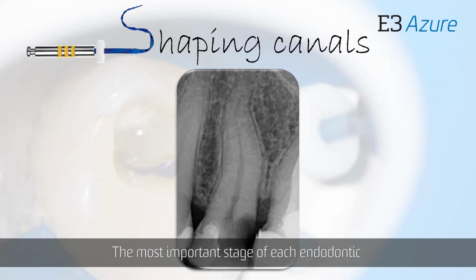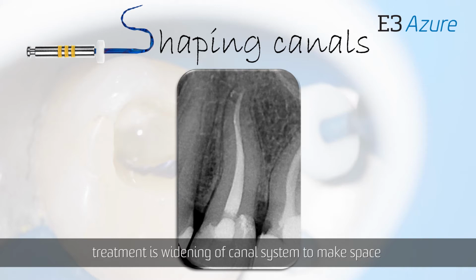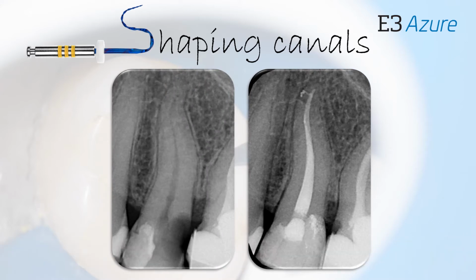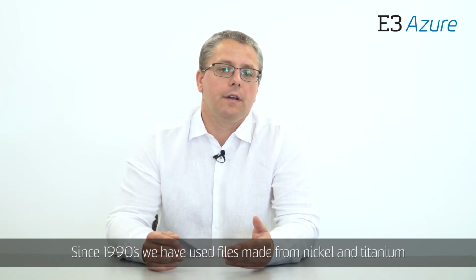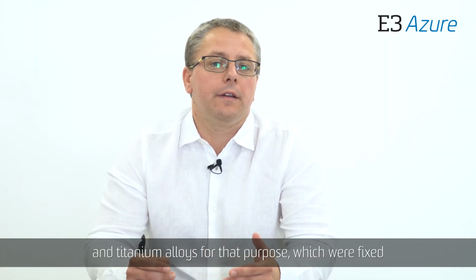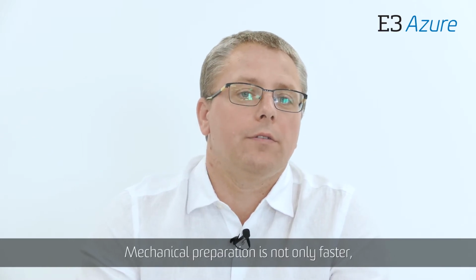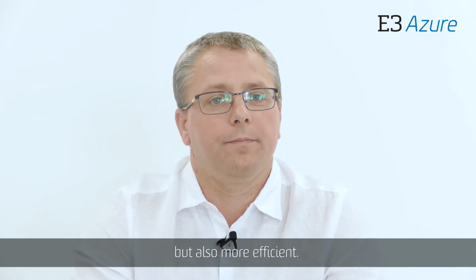The most important stage of each endodontic treatment is widening of the canal system to make space for irrigants and future obturation. Since the 1990s, we have used files made from nickel-titanium alloys, which were fixed in endodontic motors. Mechanical preparation is not only faster, but also more efficient.